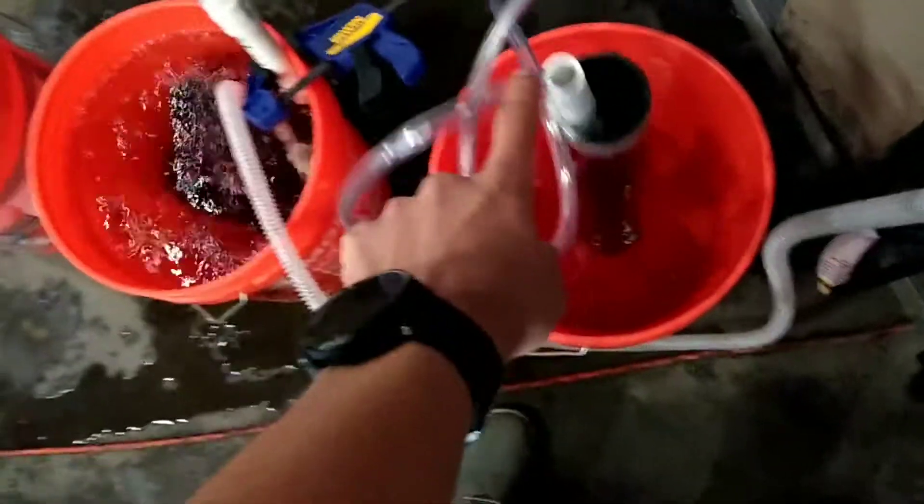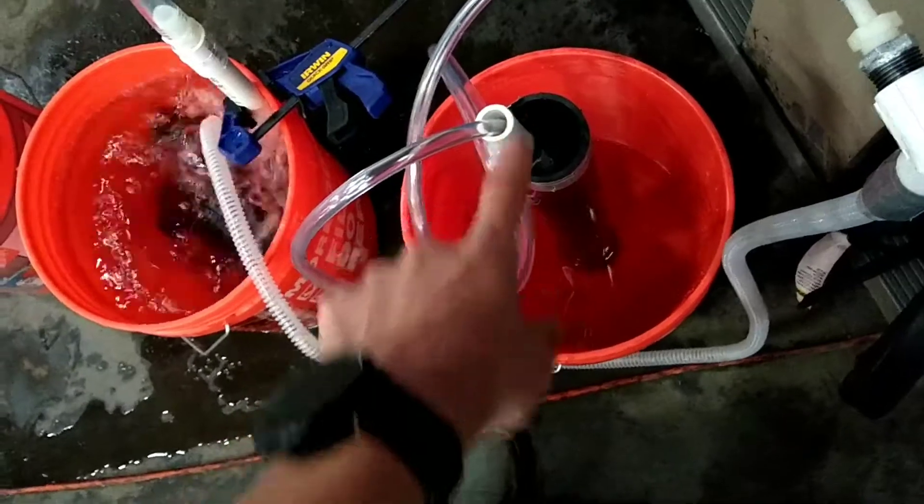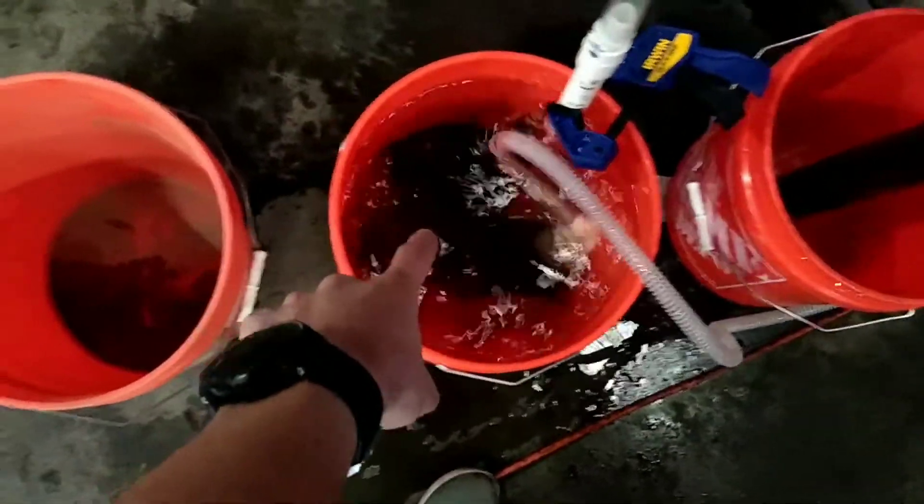First, we have the overpressure relief — that's just tubing running down this PVC under 40 centimeters of water. Then we have the patient side tubing going to our fake lung down at the bottom there.